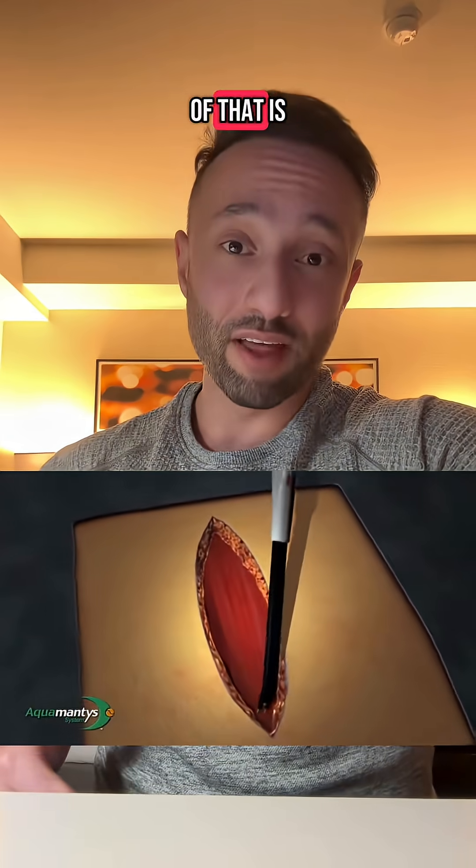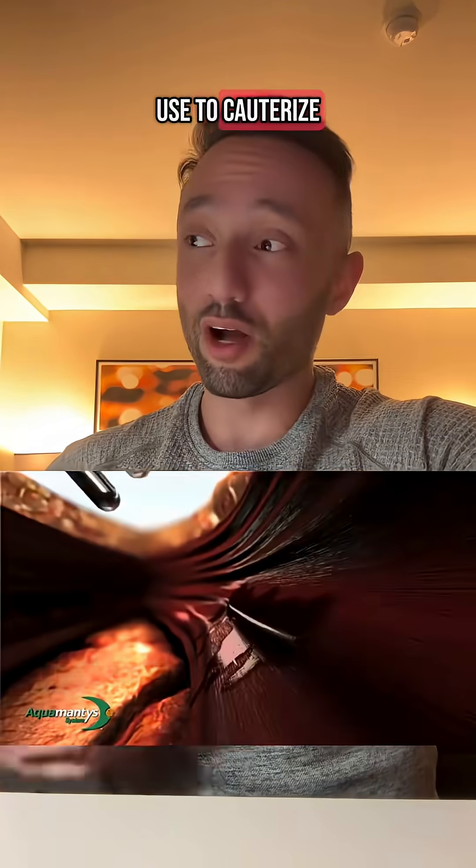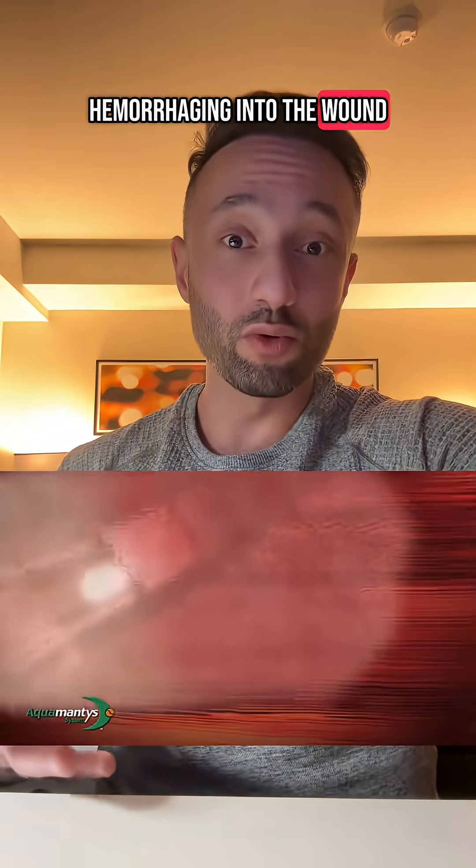Another form of that is something called an Aquamantys. Basically, we have several different instruments that we can use to cauterize the blood vessels and stop them from hemorrhaging into the wound, allowing us to see what we're doing and perform the surgery.